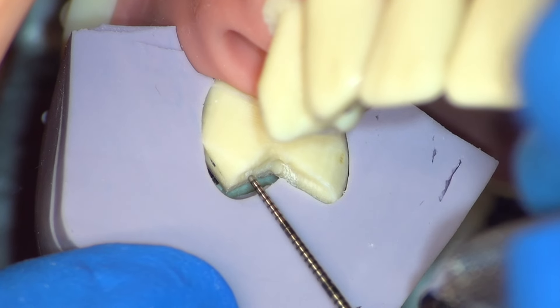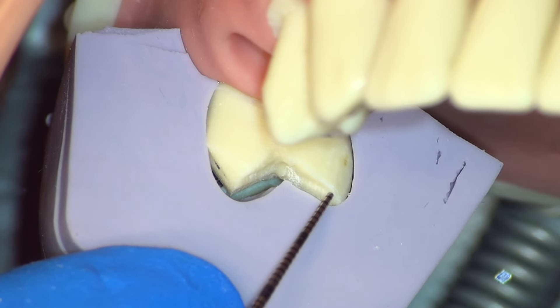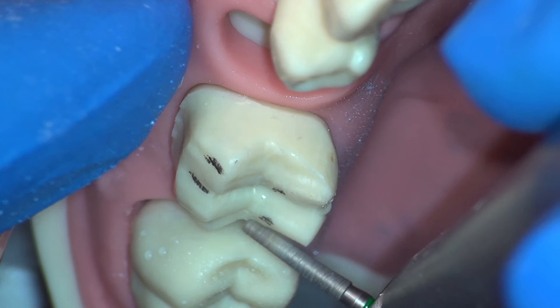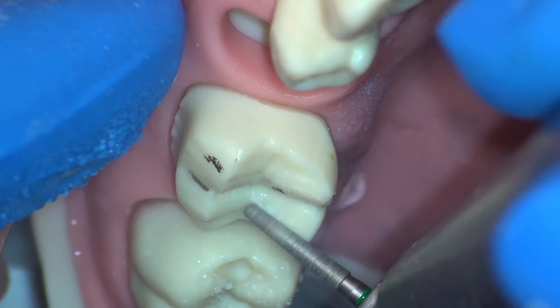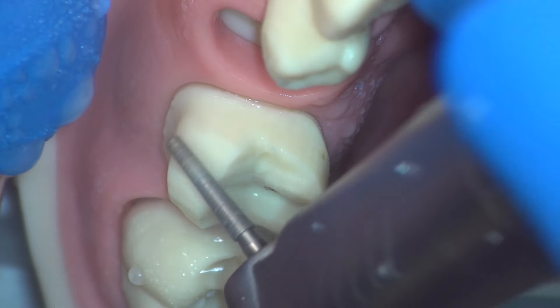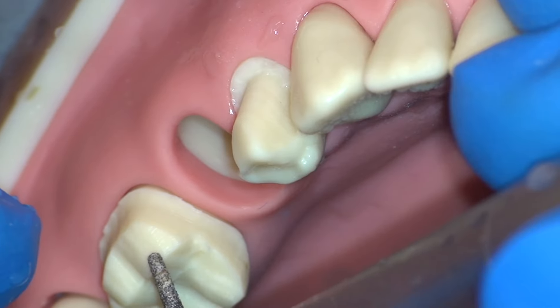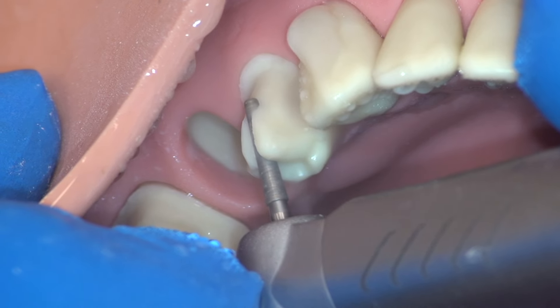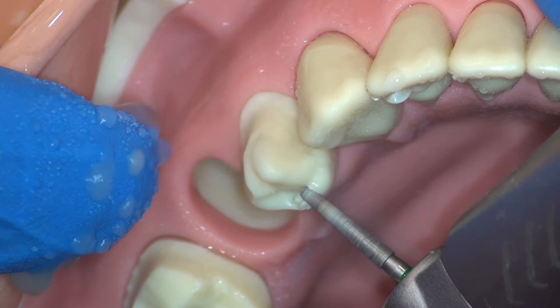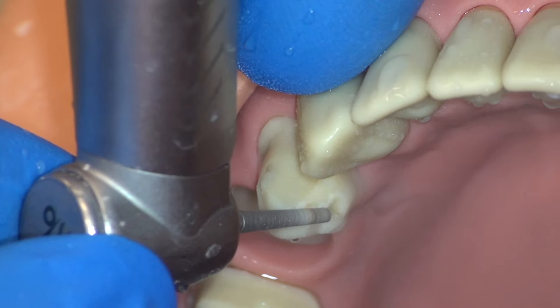We'll need additional reduction at the depth of the buccal groove. Here we have again 1, 1.5, and 1, so the buccal will need an additional half millimeter of reduction. Keep in mind that an additional half millimeter of reduction is half of the width of this burr — it is not an insignificant amount of reduction, so reduce accordingly. The premolar requires a reduction of 2 on the functional cusp bevel, 2 on the functional cusp, and 1 on the nonfunctional cusp. Here we go ahead and set those measurements to our final desired depth. Since the lingual cusp is so small, I go ahead and do the reduction and smoothing at the same time. And now we'll go ahead and set our functional cusp to 2 millimeters.